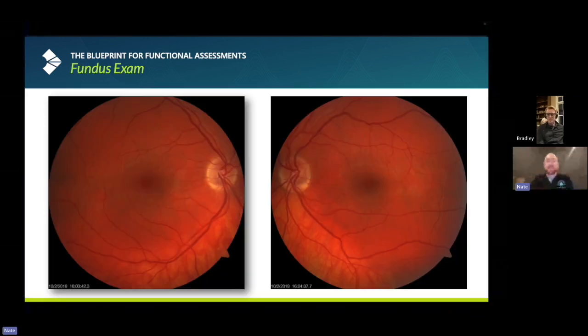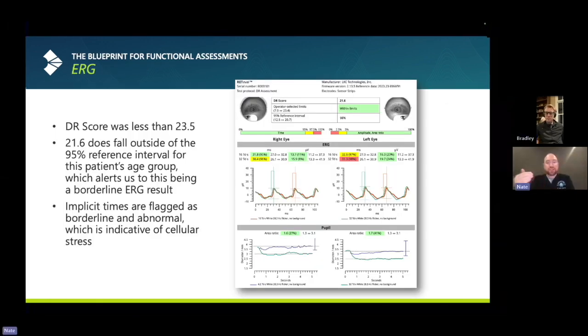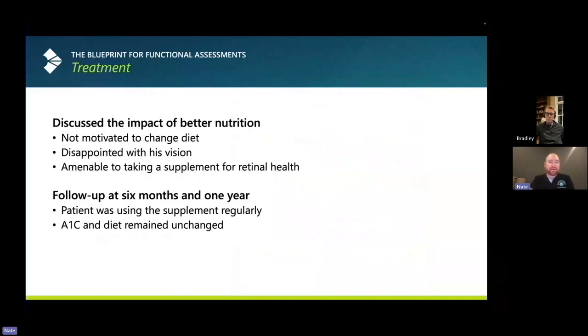When would you see this? Dr. Grant, if you didn't have ERG, when would you see this 77-year-old male whose retina looks darn good, OCTs look pretty good, without your ERG, when would you have seen this patient back? Yeah, based on photos and OCT, I'm seeing him for an annual comprehensive exam. Exactly. But the ERG changes that, going, all right, vision's down a little bit, ERG's not normal. Let's see this patient back in 6 months, and maybe 6 months after that.